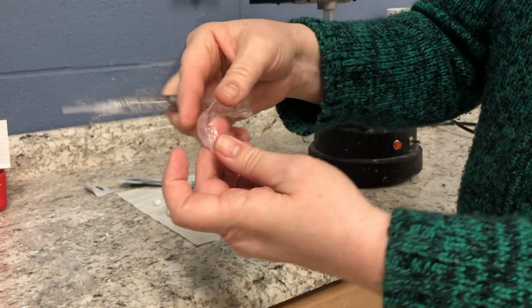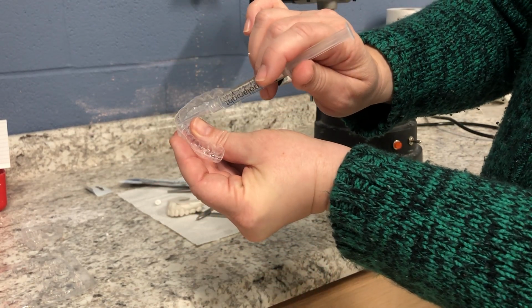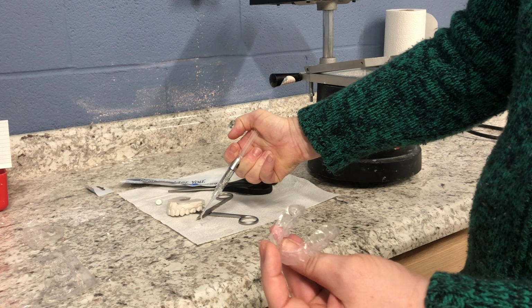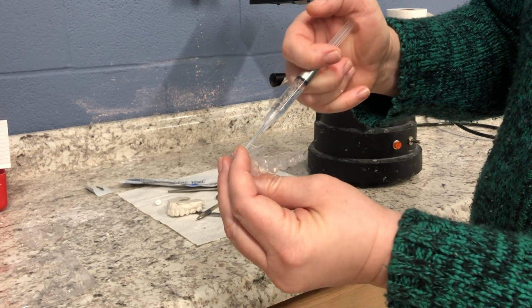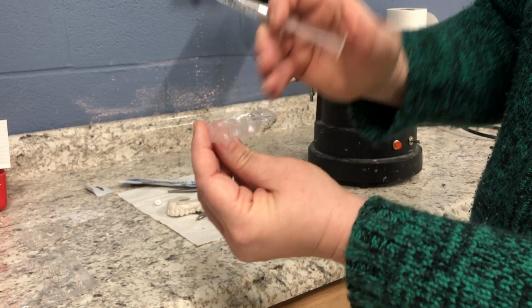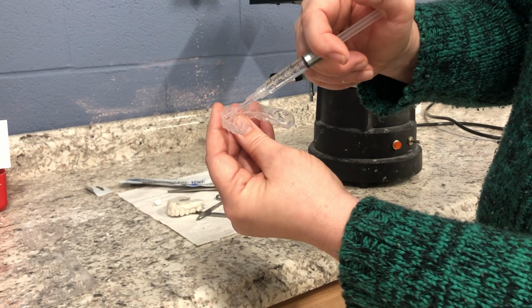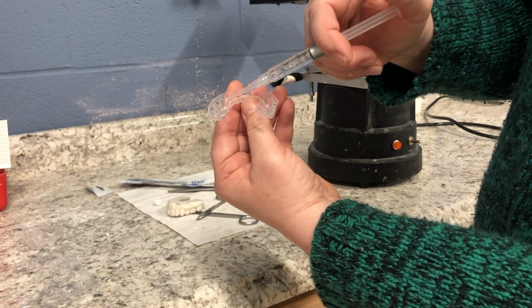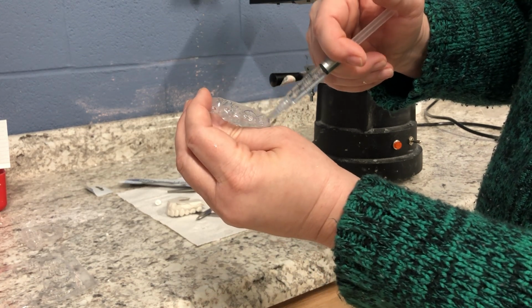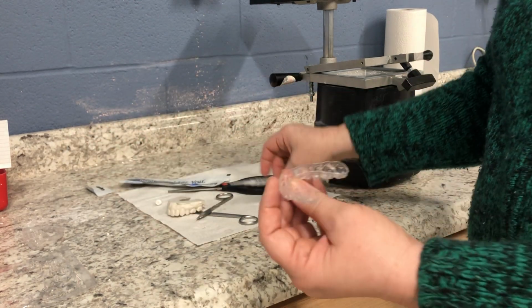And what you want to do is where it's going to rest against the teeth, you only want to put this right on the back. And it'll come out a little bit fast initially, so I'm going to put a little drop, a quarter of a pea size. Can you see that pretty good? Mm-hmm. Okay. Right there on the middle of the facial. And you'll do this for a few nights in a row. And if it gets sensitive, skip a night until your teeth aren't feeling sensitive. Pull back so it doesn't continue to ooze out.